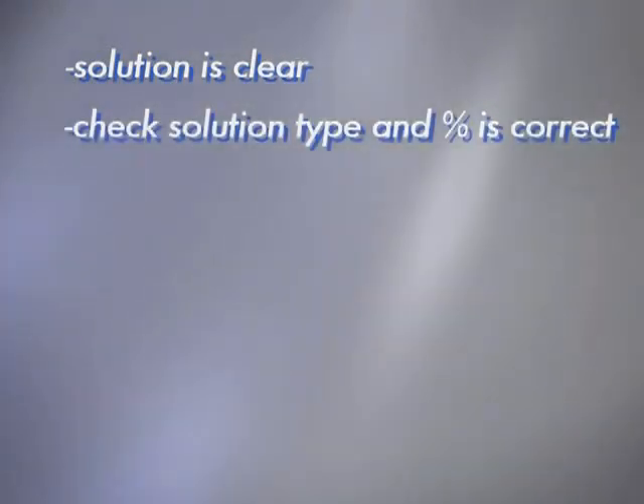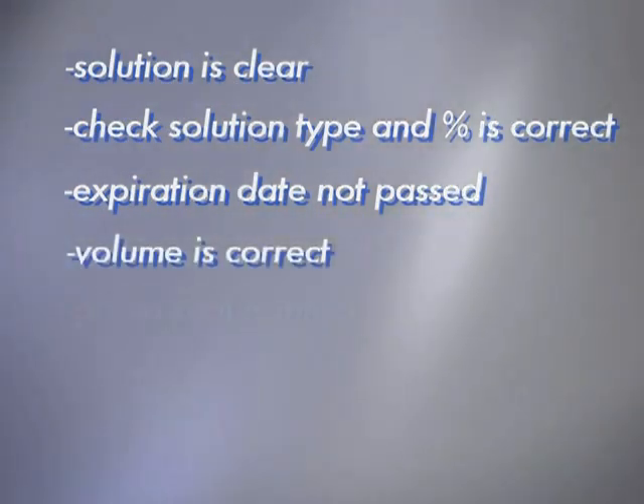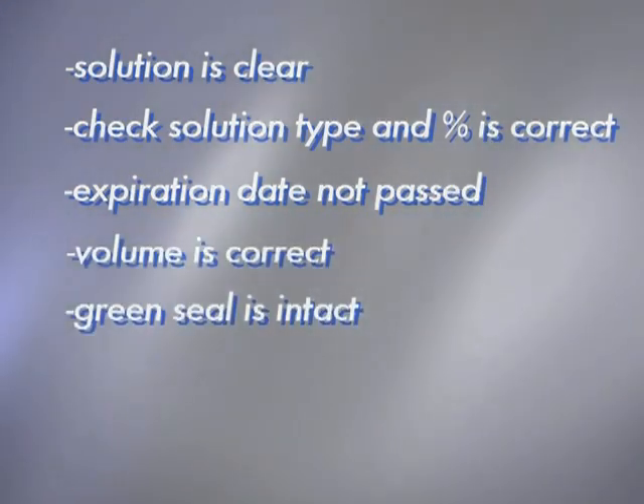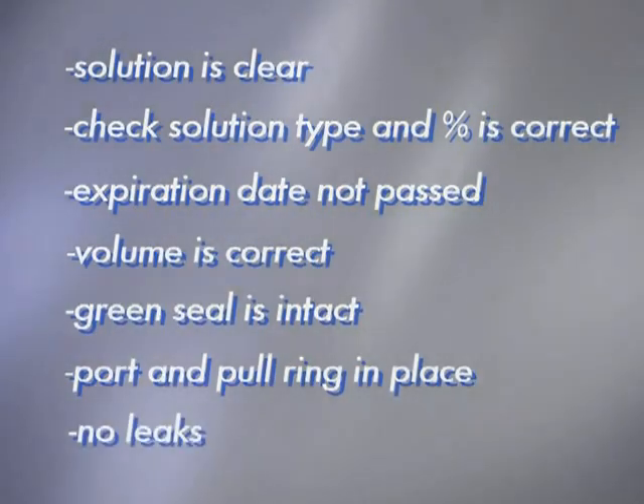The solution type — Dianyl, Extranyl, or Neutranyl — and dextrose percent is correct. The expiration date has not passed. The volume is correct. The green seal is intact. The medication port and pull ring are in place. After gently squeezing the solution bag, there are no leaks.